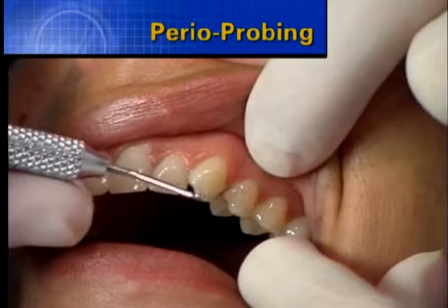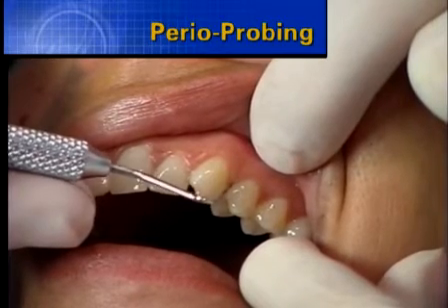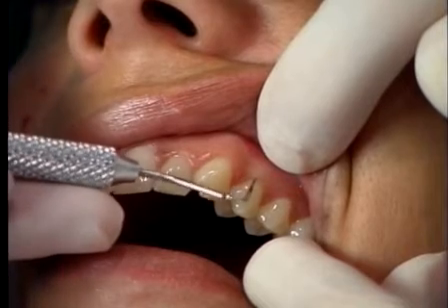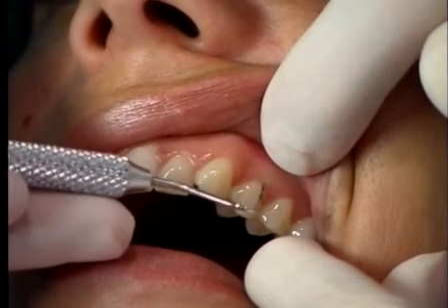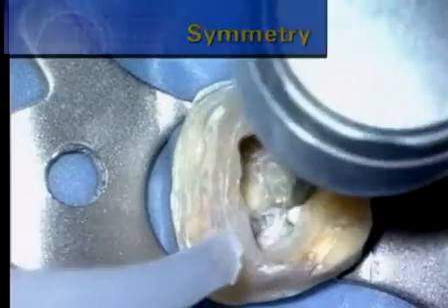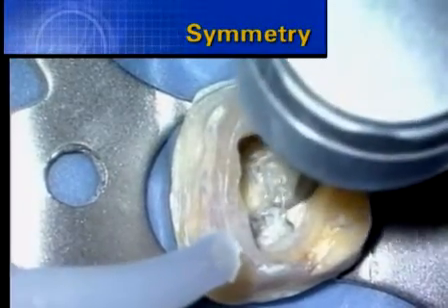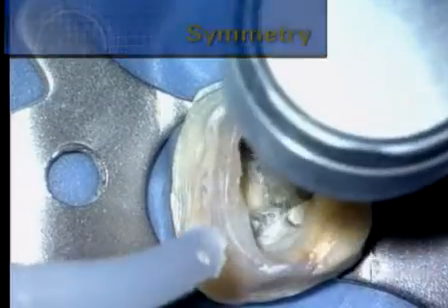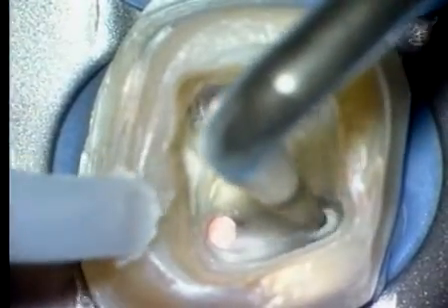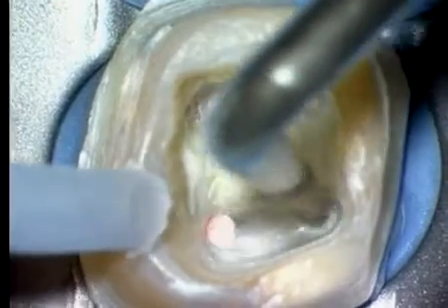Another important idea for locating canals is to carefully probe the sulcus. This can give us important information as to the relationship between the long axis of the clinical crown and the underlying root. Another concept for finding missed canals is to use orifice symmetry principles. In this failing case, I'm locating a distal lingual orifice.